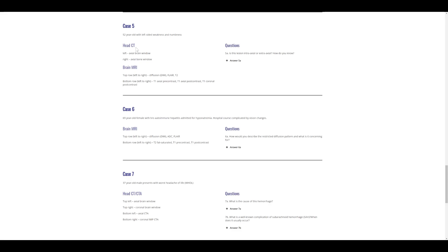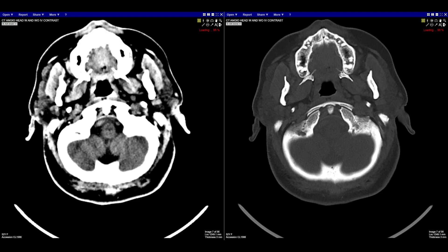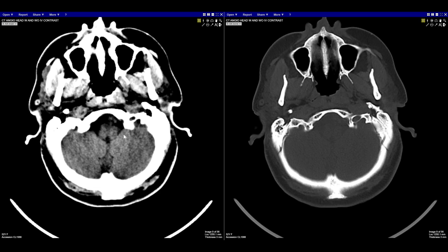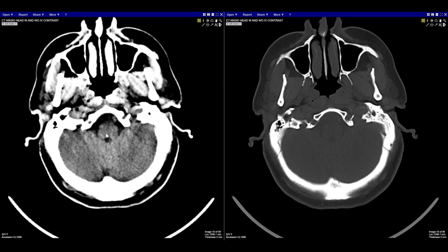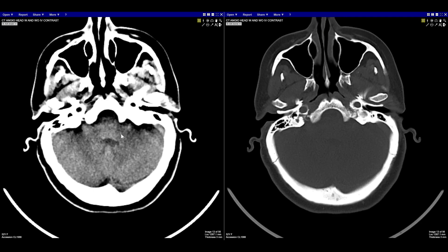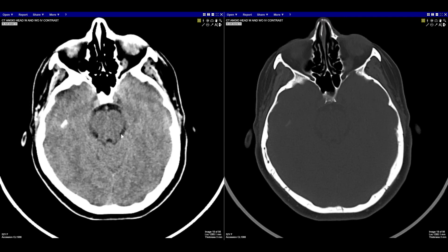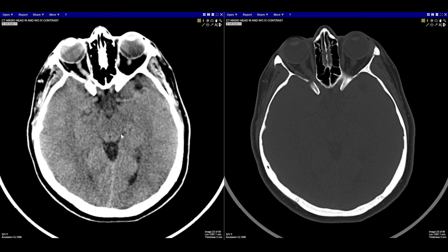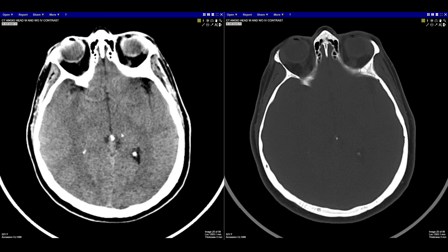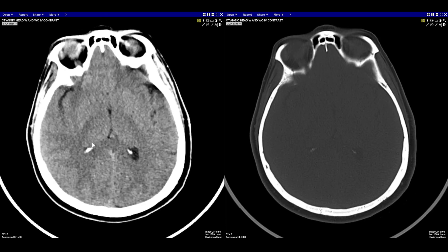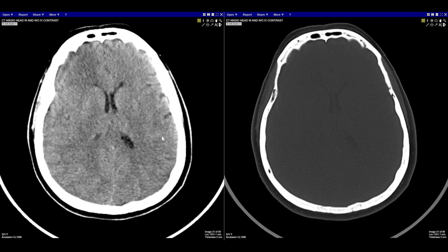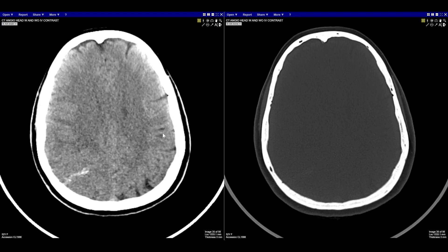Here we are on the website with case five. We have a head CT — on the left a brain window, on the right a bone window. We're going to follow our pattern, looking at the skull base starting with the cerebellum and the posterior fossa. Everything's looking pretty good so far. We do notice this right lateral ventricle is a little bit smaller, so maybe we're looking for some pathology on the right.